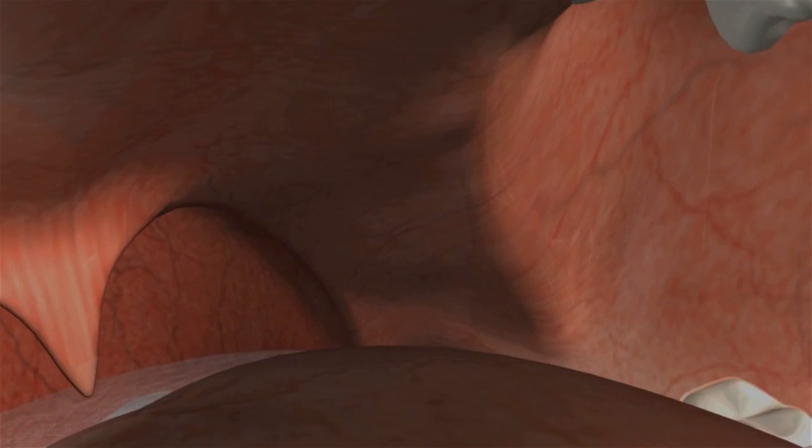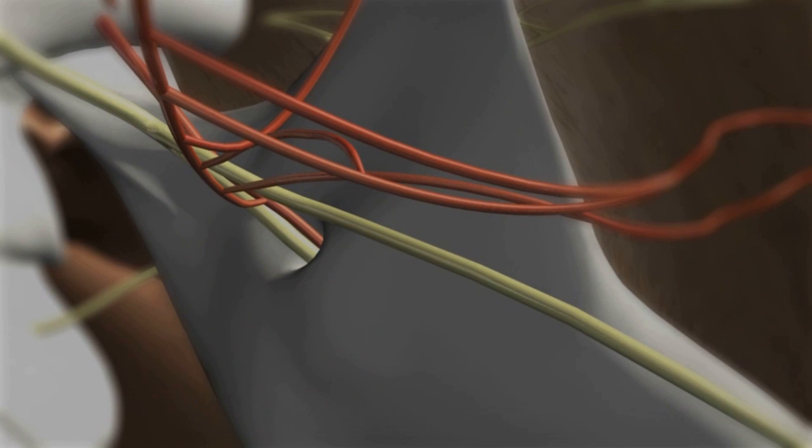You can see the lingula and the coronoid notch. There is the inferior alveolar neurovascular bundle as it enters the mandibular foramen, behind the lingula. The lingual nerve is seen taking off from the inferior alveolar nerve, just before its entry into the mandible. In giving the injection, your goal is to contact the bone just behind the lingula to achieve the inferior alveolar nerve block.